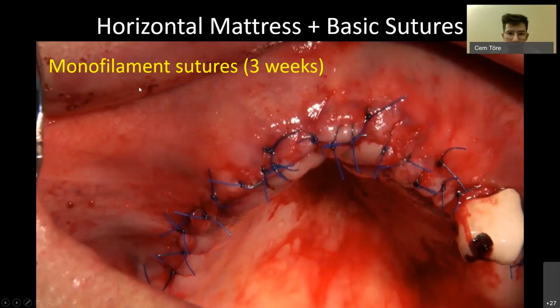And the other point is, as we know, basic sutures just connect two dots. We need to close an area in augmentations, like we have after we release the flap. So in the beginning, you have to place horizontal mattress sutures. These are the ones in question here, 1, 2, 3, 4, 5. And you can see the difference between the entry points. Basic sutures are basically right next to the incision line, 2-3 millimeters from the flap.